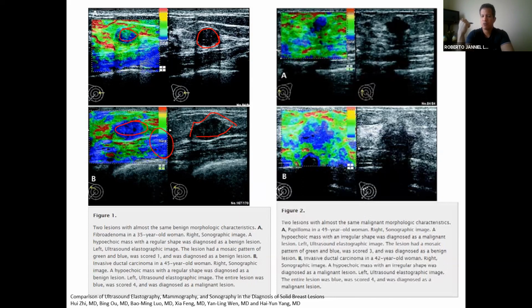When looking at elastographic images, there are several things to talk about. And again, for example, you can argue, here I see something reddish, and in here I also see something bluish. So you don't use elastography alone, look at it, and if something blue shows up, that's it. You have your echographic image, you know the lesion that you're going after. So if you know that there is a lesion and you focus only on that region, is that detection or is that diagnosis?